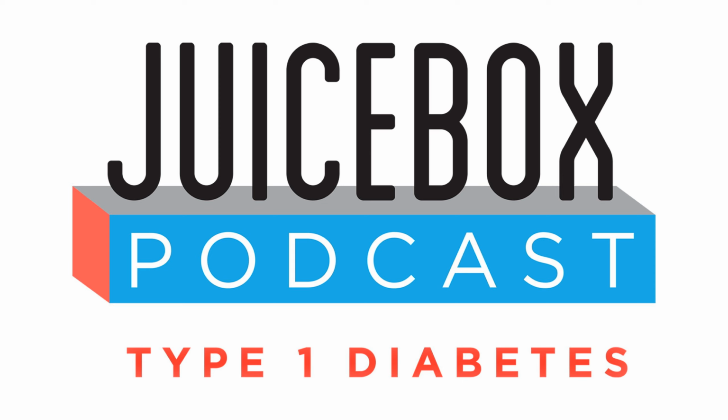But yeah, so basal is what it's supposed to be, but Loop sees basal as neutral, as free insulin, as zero. It doesn't track it. It trusts that you said, hey, I need this much insulin as a baseline for my body. And so it doesn't really keep track of that. So if you have basal too high, the insulin on board number may show that you have zero or maybe even a negative number.